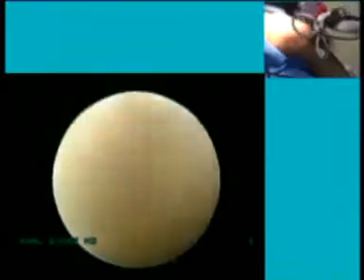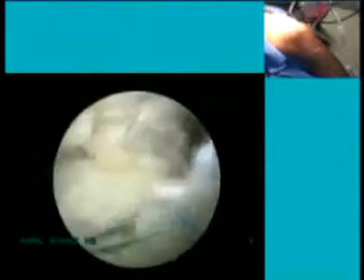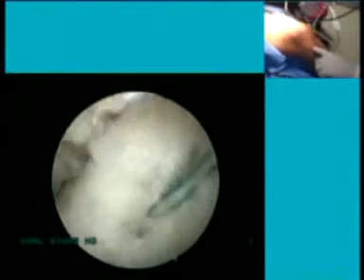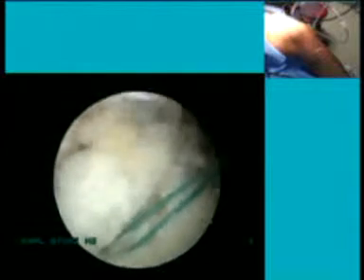I have to wait a little bit for the graft. Failure of double bundle and then putting in a bone graft, a strut bone graft inside, it may heal, may not heal. How long will you wait before you do a revision ACL?